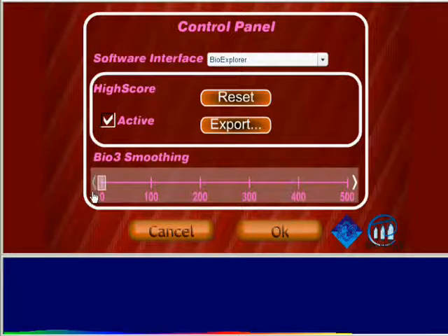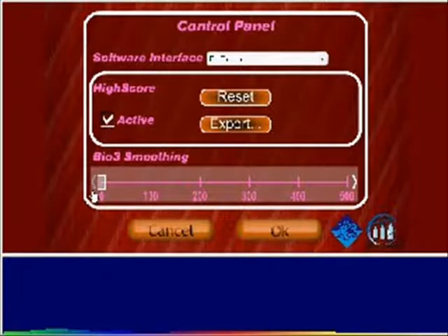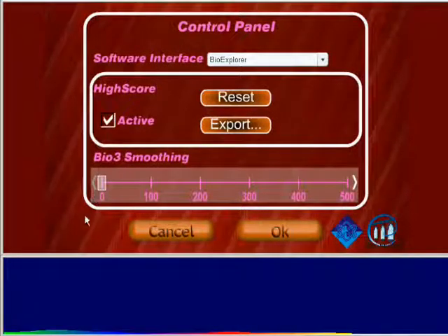Skip this step if you have smoothing enabled in BioGraph Infinity. All Bio Explorer designs include averaging, so this step is not necessary when using those designs.